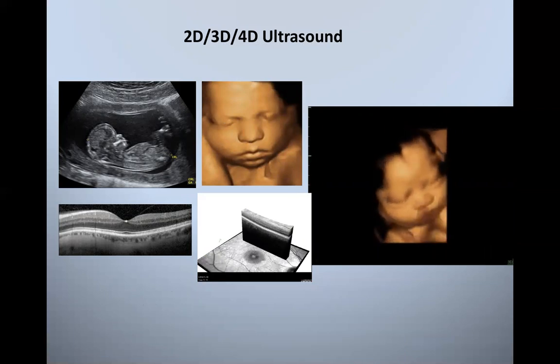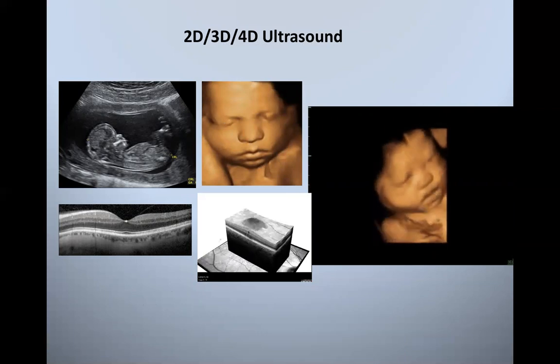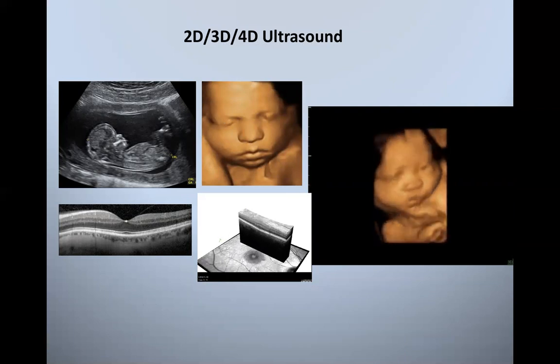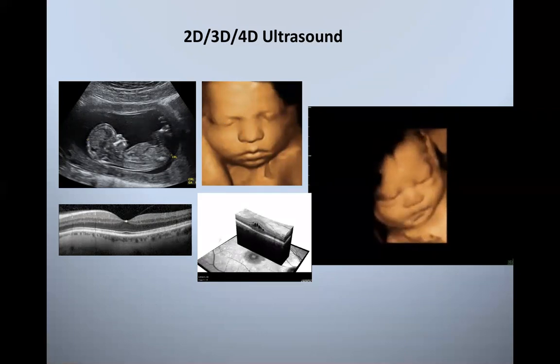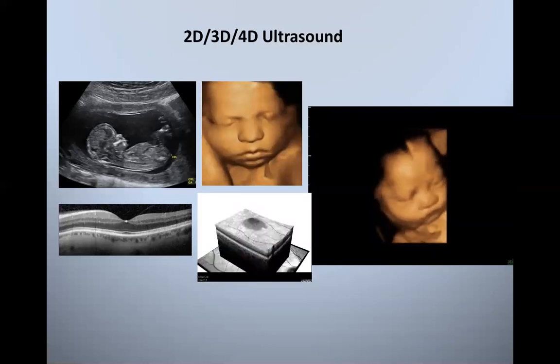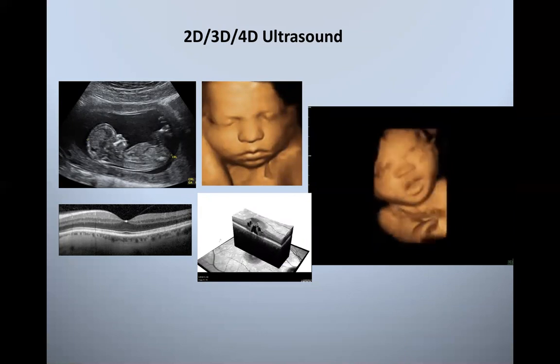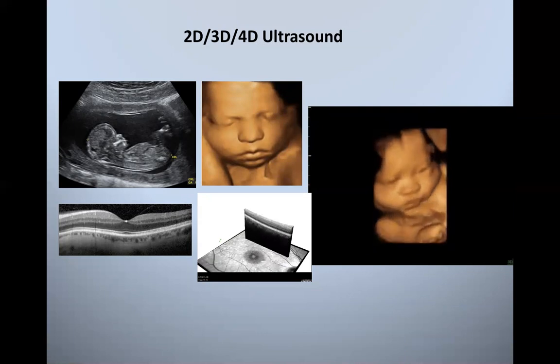So think about OCT when it sends that infrared wavelength of light through the back of the eye, and it looks at the tissue structures as it comes back through. Now imagine several of those scans, sequential scans, immediately one right after another. And then the system will look at all of these scans and figure out what changed between them. And the only thing that changes that fast in the back of the eye is blood flow. All the other structures of the eye do not change that rapidly, or they don't change at all, or they don't move at all.